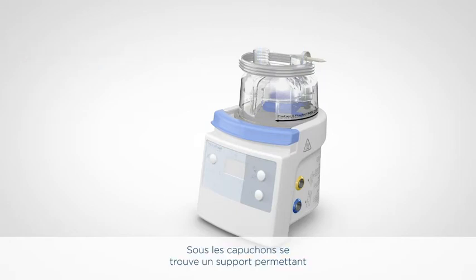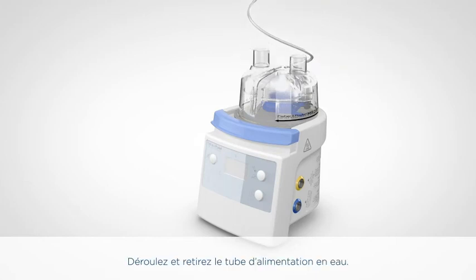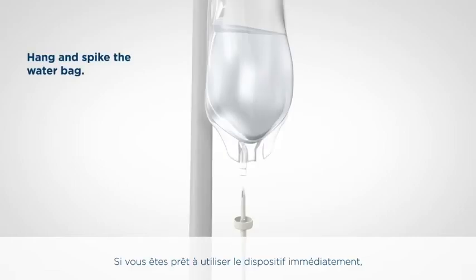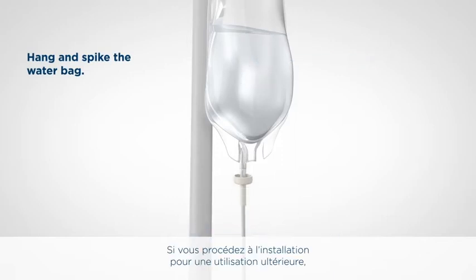Under the port caps there is a water feed tube holder. Unwind and remove the water feed tube. If you're ready to use the system immediately, hang a water bag on the water bag pole and spike the water bag. If you are setting up for future use, the water feed set holder can be used to protect and keep the water bag spiked clean.